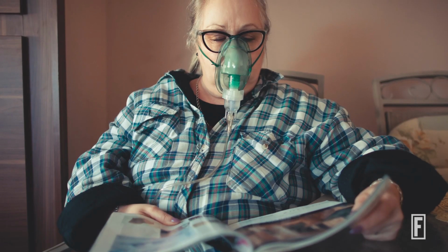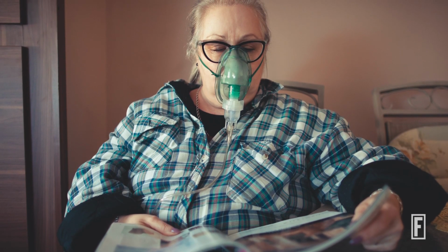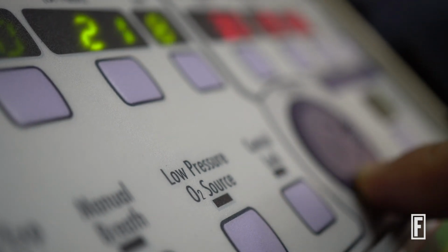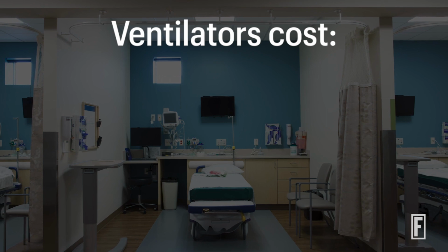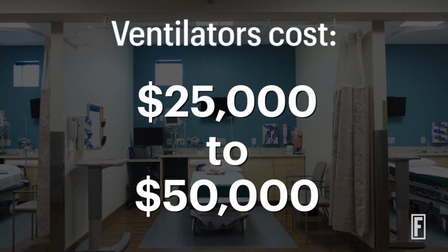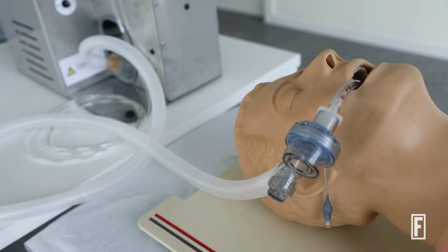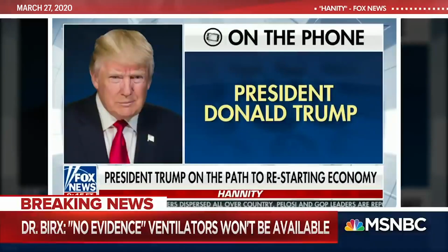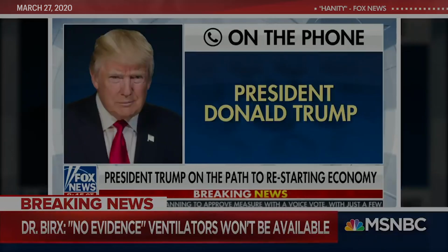But the ventilators that are in the news because of the coronavirus are high-end, complicated, and expensive hospital ICU models. They can cost between $25,000 to $50,000 a unit, and they involve putting a tube down a patient's airway and actually helping that patient breathe while they're in critical care and their lungs might not be functioning. But I have a feeling that a lot of the numbers that are being said in some areas are just bigger than they're going to be. I don't believe you need 40,000 or 30,000 ventilators.